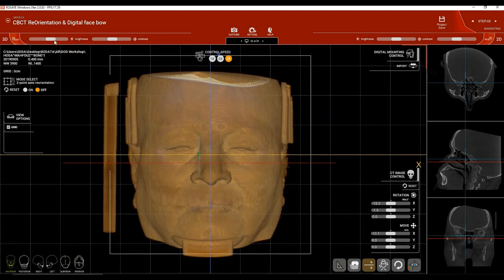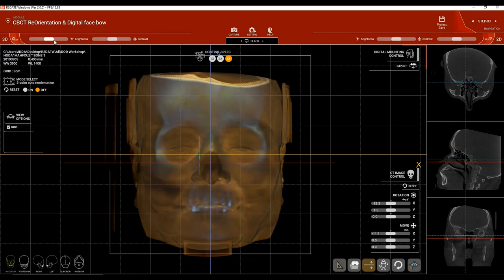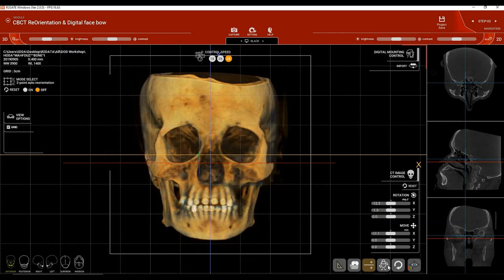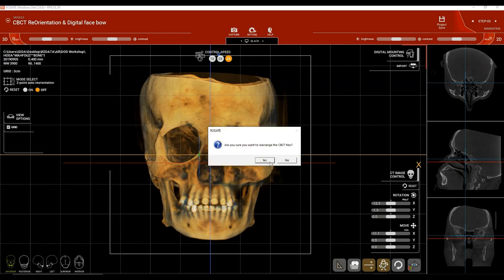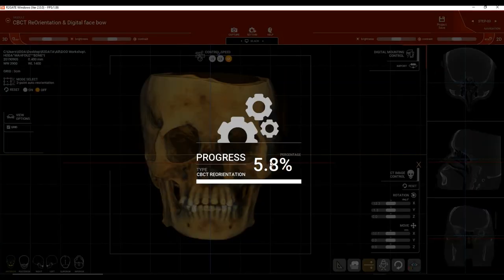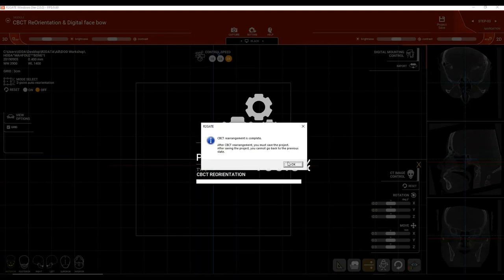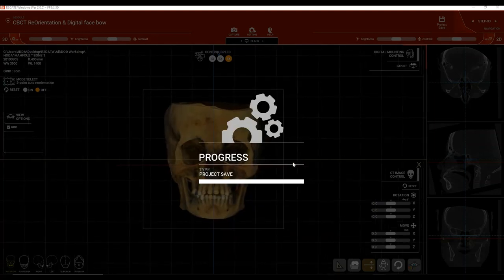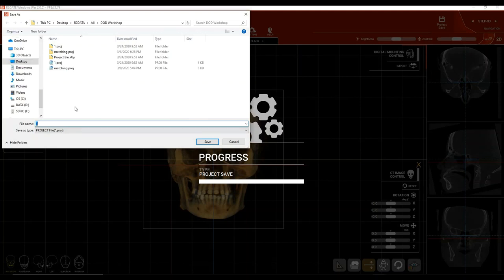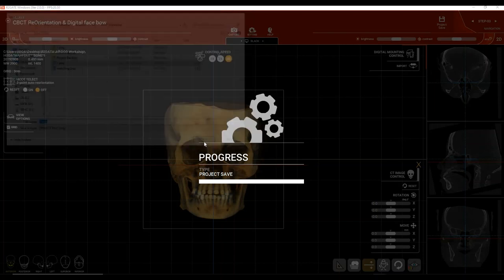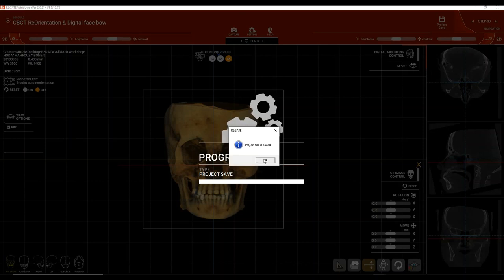Once CBCT reorientation is complete, click on the lower right side of the image and click 'Save CBCT Reorientation,' then click Yes. Go ahead and save the project file under the project name you chose at the beginning.